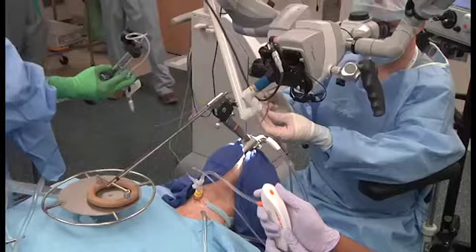When a stable plane of anesthesia was achieved and the suspension laryngoscopy in place, resection of the supraglottic stenosis commenced. A protecting platform spatula is placed behind the stenotic area. The surgical laser is now used to open up the stenosis. Cold knife scissors and a balloon dilatation technique will also be used.